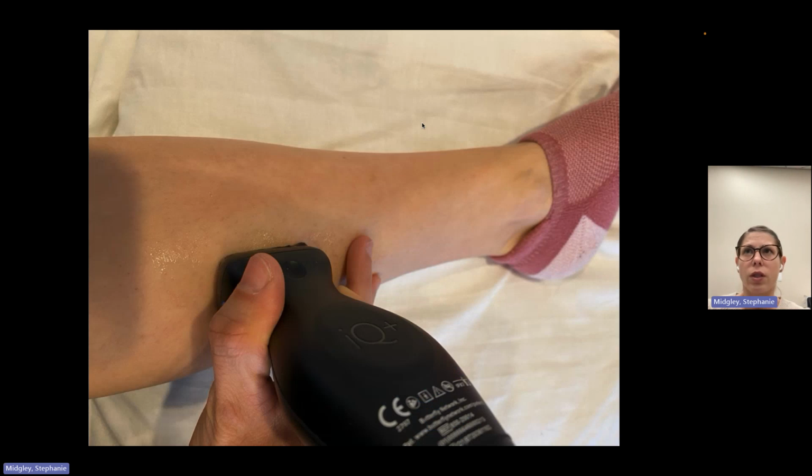The first thing you want to do is, I always like to start in long axis. For me, that's an easier thing for my eyes to process because the muscle fibers are nice and long and continuous. If you notice, there's no sign of infection where I'm scanning here. You always want to start far away from the area in question, the area of cellulitis, for a couple of reasons.